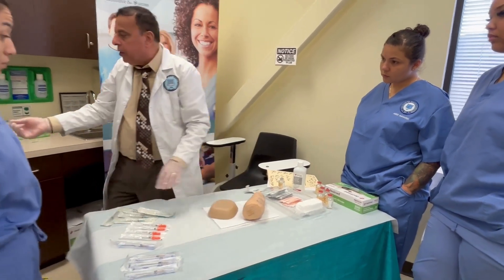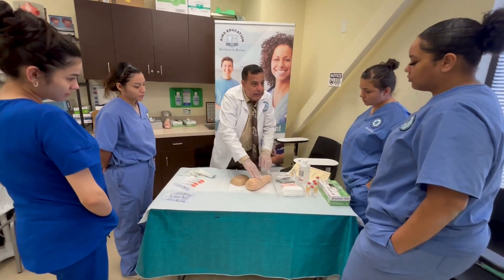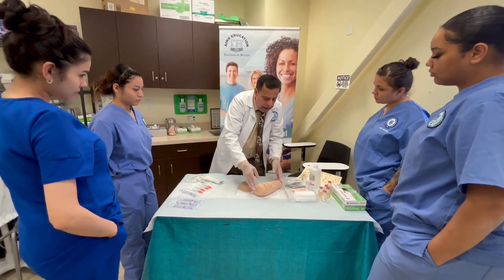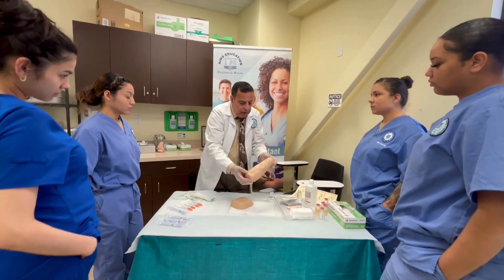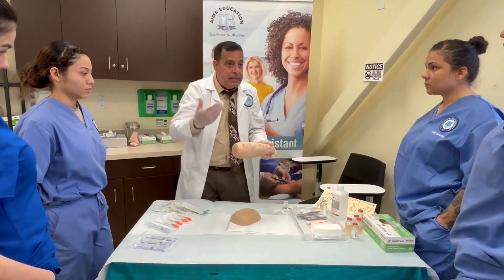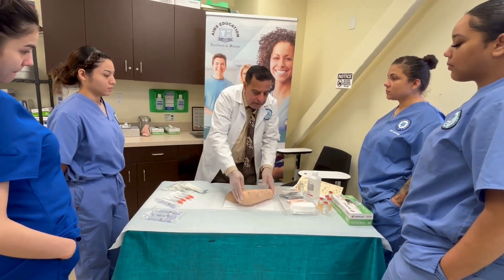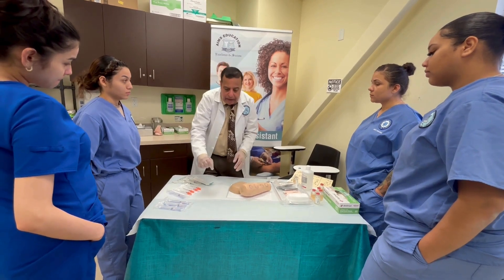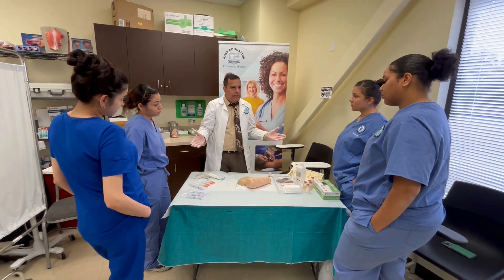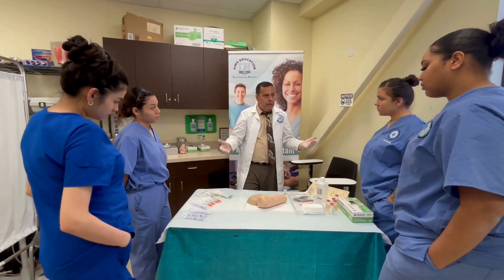The needle must go right away into the sharps container. That was six rights — the seventh right, number seven, is: after the patient receives the injection, look for any allergic reaction — any redness, swelling, blurring of vision, numbness. The seventh right is the right documentation. After 10 minutes, check the site — if everything is perfect with no abnormal reaction, document it and you're done with the injection.